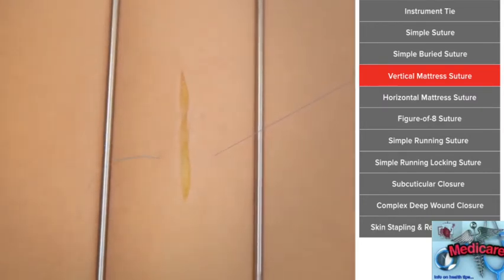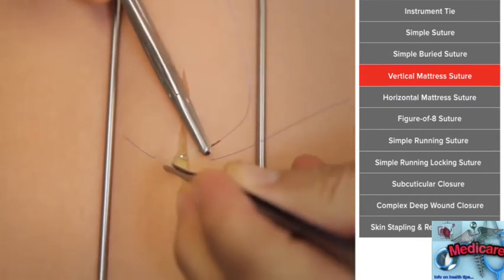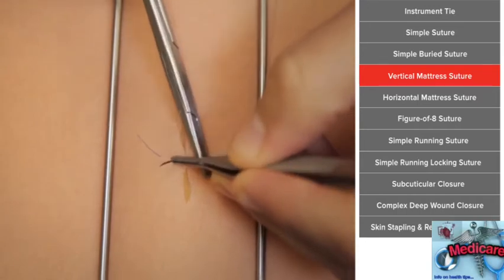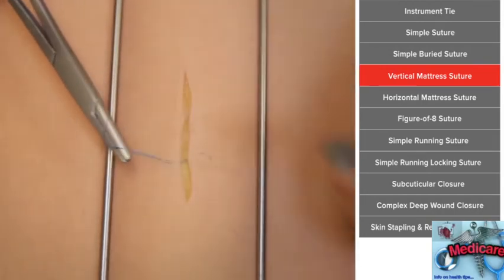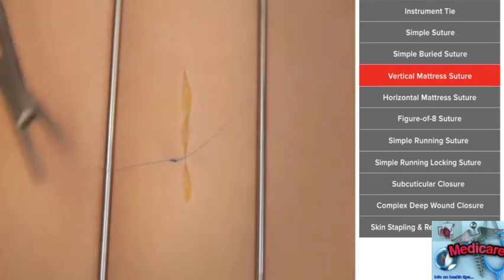So notice I've gone into the skin, along the bottom of the skin, and gone far away, and now I turn the needle around and come back and do nearer and nearer to the incision. And what this does is going to pull the tissue between each of those throws together, as opposed to just pulling the edges of the skin together. And again, you do your instrument tie, and generally I'll pull it tight just so I see the skin kissing.